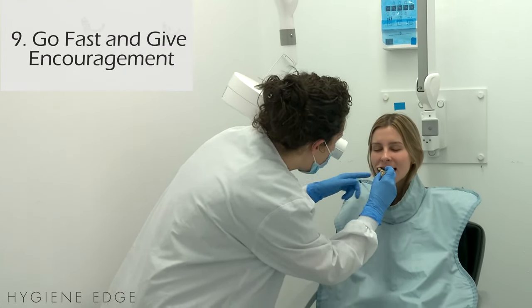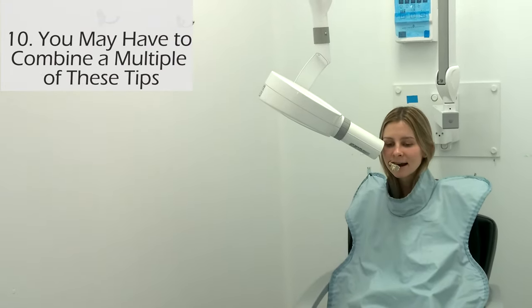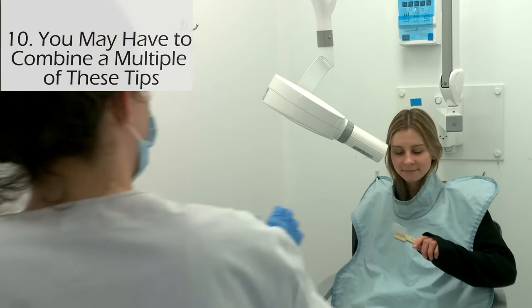And remember, you're going to have to go fast and give your patient lots of encouragement. And last but not least, you may have to try all of these things.